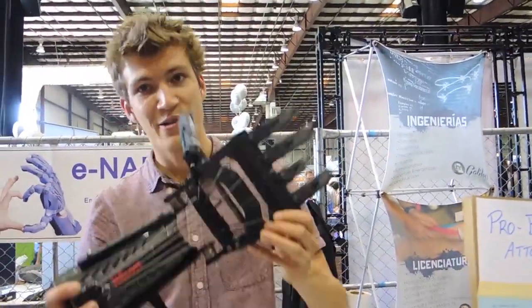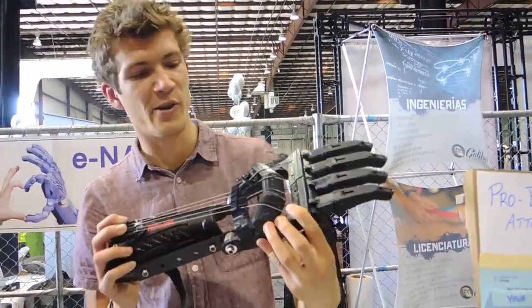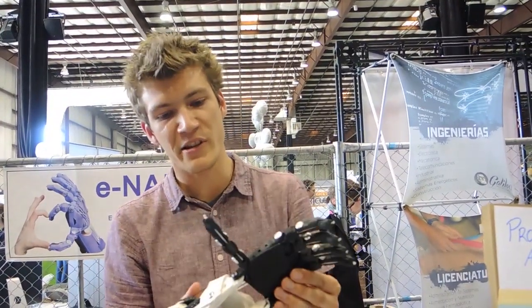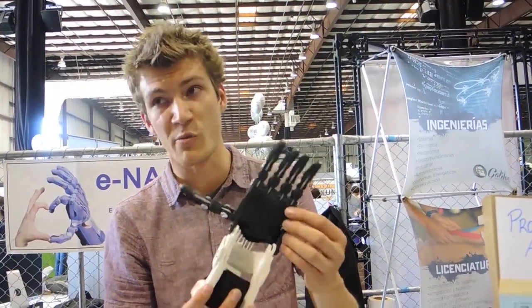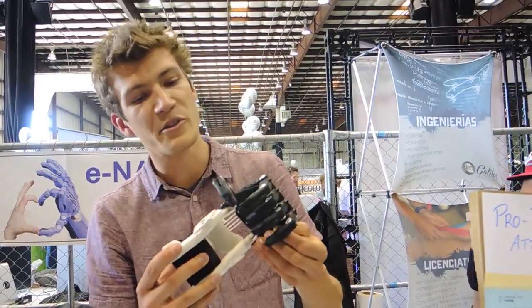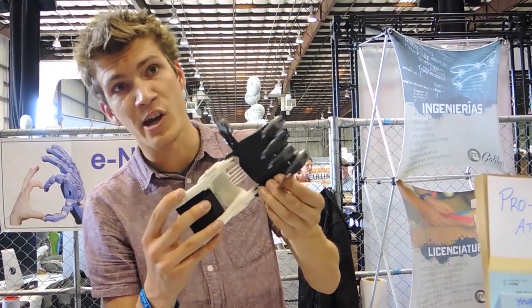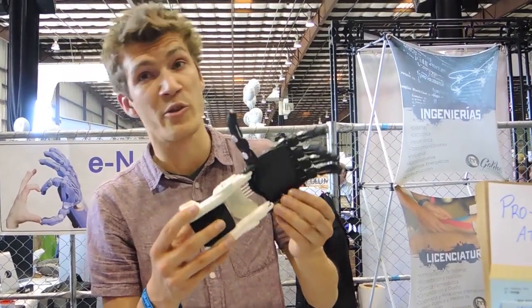This is a large version that we just brought for demo purposes today. This is a two-scale version, actually made for an individual missing their fingers. You can see by bending at the wrist, you can enable gross grasp. It's entirely body-driven — no electronics, no motors, no sensors.